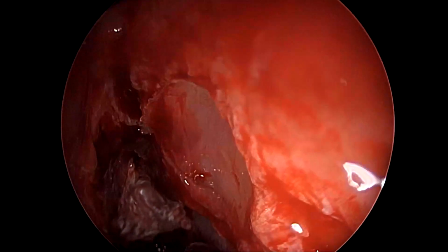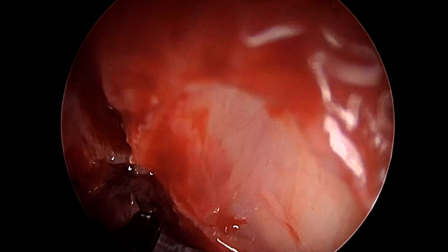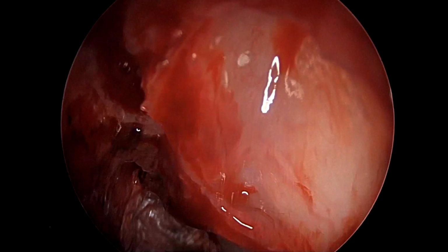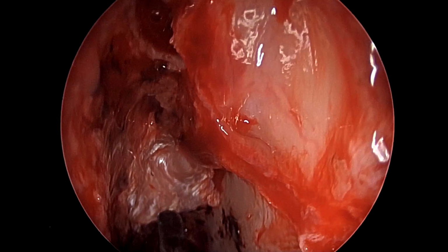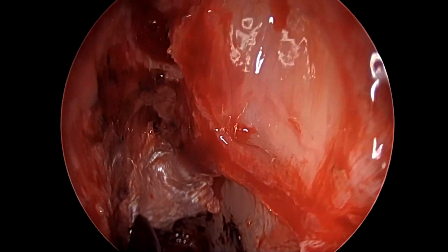As we see here, our graft has been well set. It was all on the bone. We had removed practically all the mucosa inside that region, so it is well placed and well set with the use of tissue glue, and all that seems to be left now is just trying to make sure that the edges are well in contact with the bone.